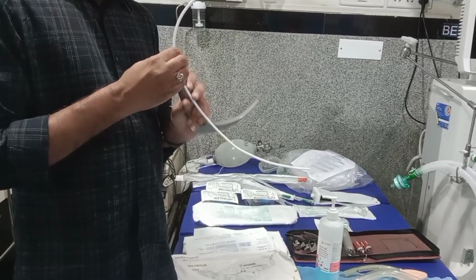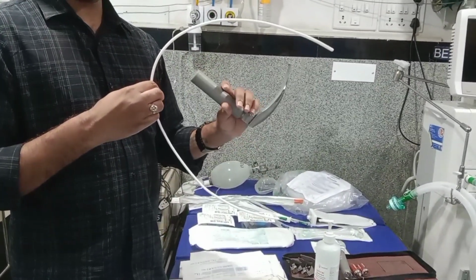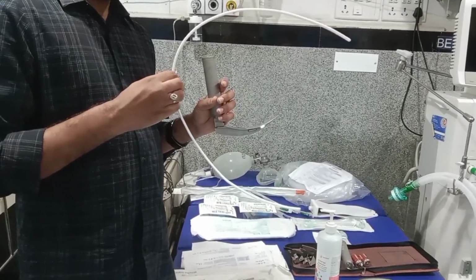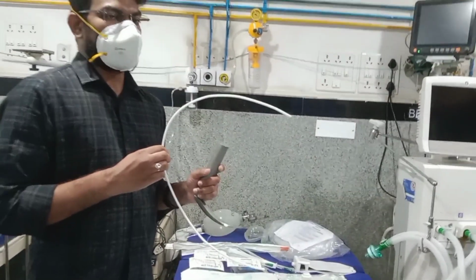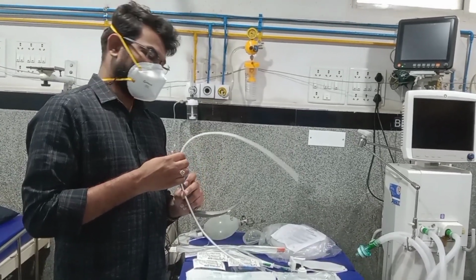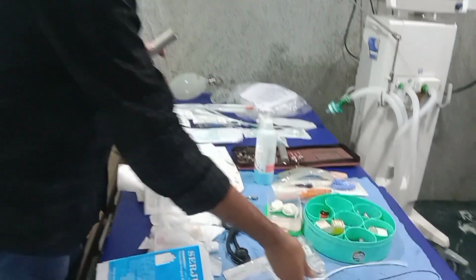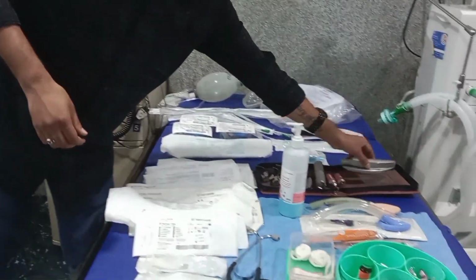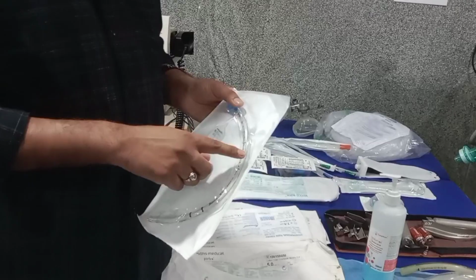We slowly push the tube through this end, and once it enters the trachea, the body will give a jerking movement. It's a response from the brain. So once the tube is inserted, we can remove the bougie. We should make sure that the tube is in the right place or not. By seeing the tube's internal lining, there will be a fog formation inside the tube. Okay, that is one confirmation.